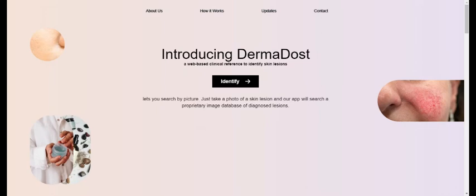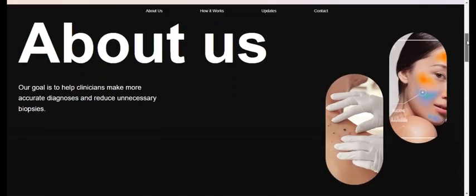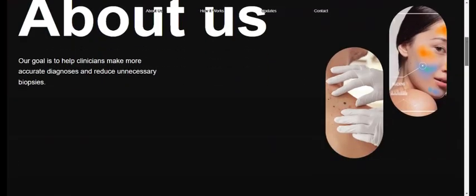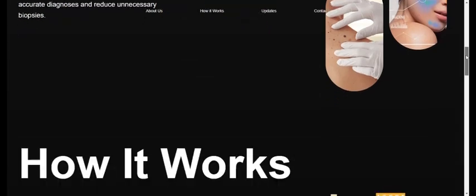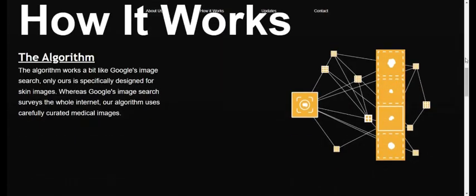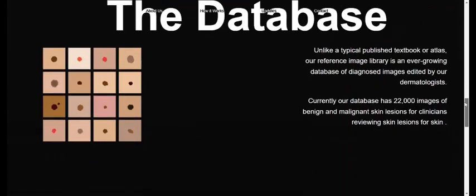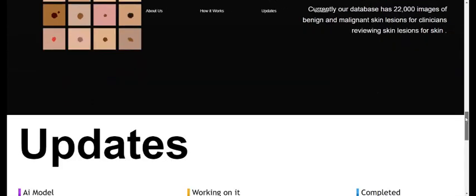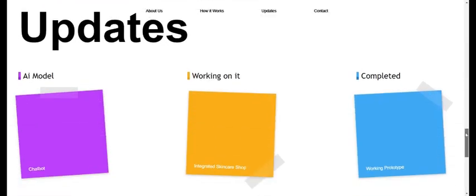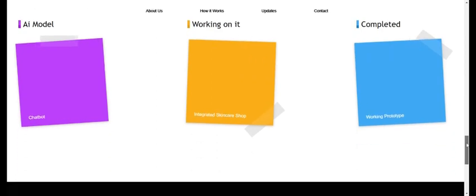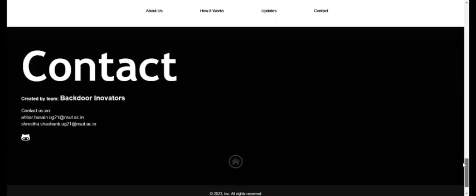So let's have a look at how the website looks. This is the home page. Here we have a little about us section, a brief introduction to how our model is actually working, some info about the database we are using, some recent updates we have done, and at last we have the contact info.